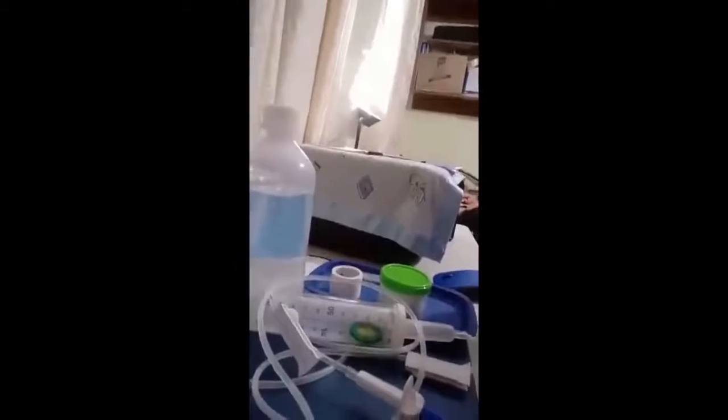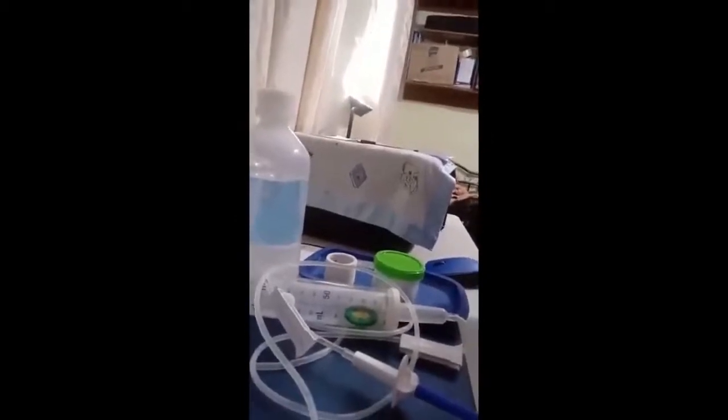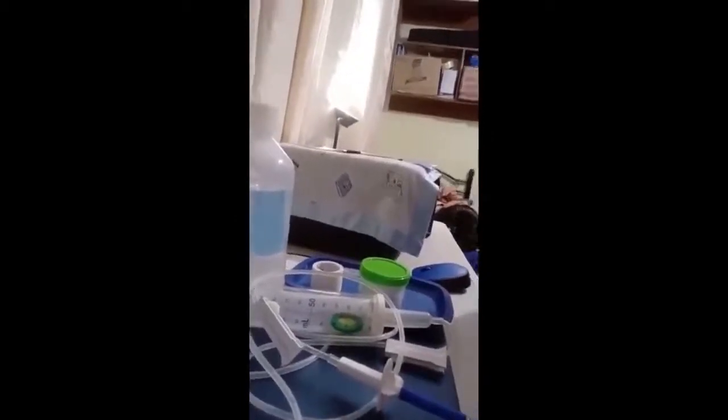Okay, next is we have to assemble the medication and supplies at bedside.